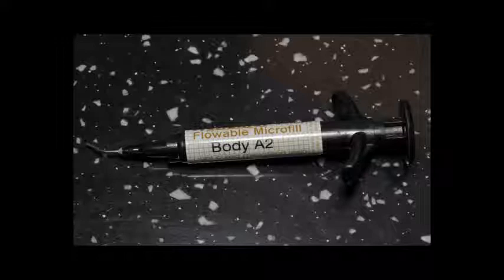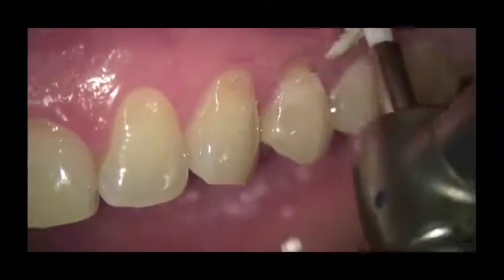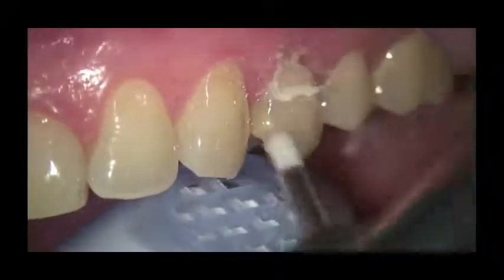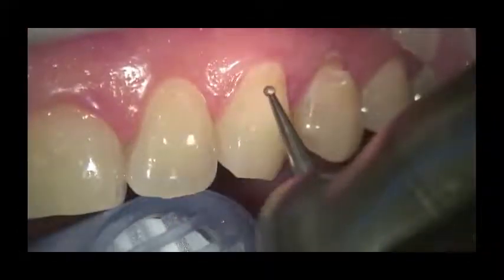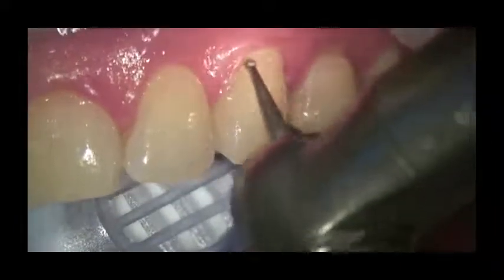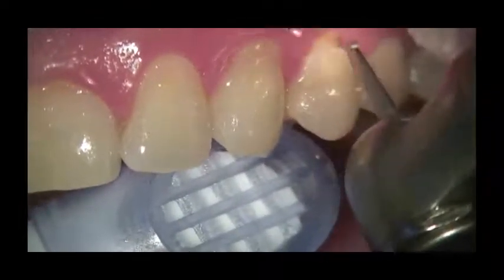In this case, I'm going to be restoring 3 teeth with erosion. I believe it is erosion or abfraction or abrasion lesions. As I said, I'm not going to get into what caused these. We're going to start off by using some pumice to clean off the root surface and the tooth surface so we have a nice clean surface for bonding. And then I'm going to roughen the surface a little bit with a fine diamond. I'm not going to prepare these a lot because I'm going to rely on my bonding technique to adhere the restorations. So we're just going to do a light roughening of the surface so I have nice, clean, fresh dentin to bond to, and basically have the surface ready for bonding.